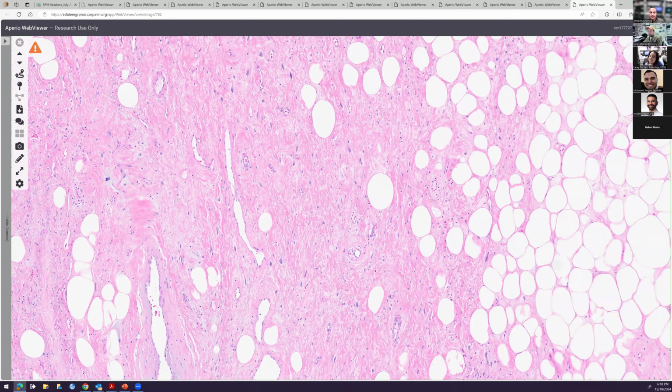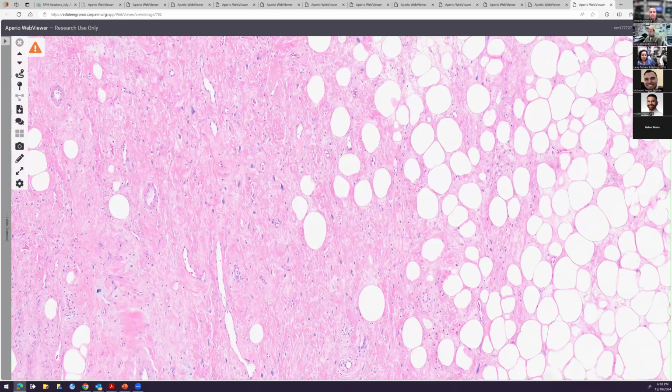But when you think about this, you should always be thinking about ALT, while keeping in mind there could be other things in this differential that you might include. Just keep in mind that there's a little more atypia than you might expect for just a general spindle cell or pleomorphic lipoma. It reminds me of the more hyalinized version of the ALT that we looked at earlier.